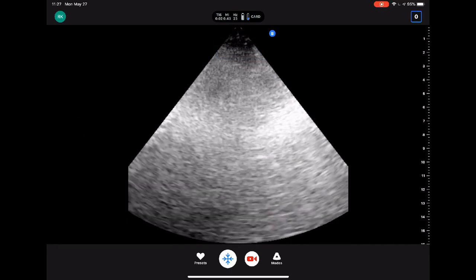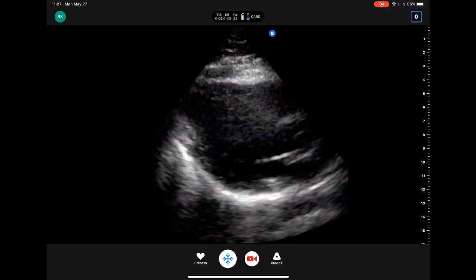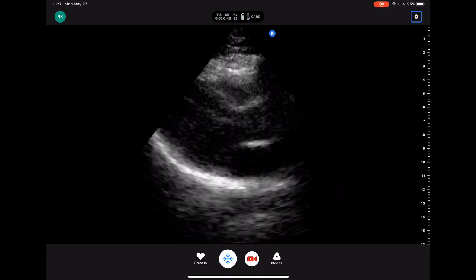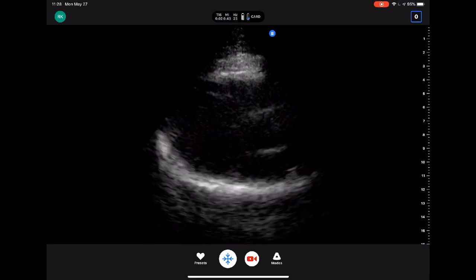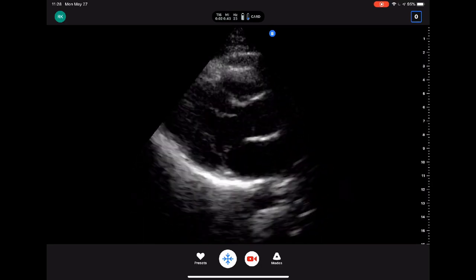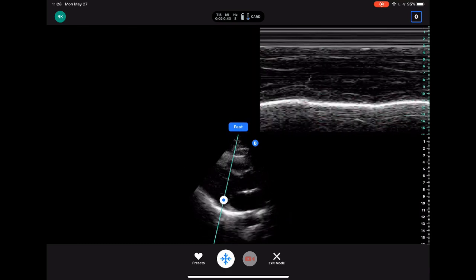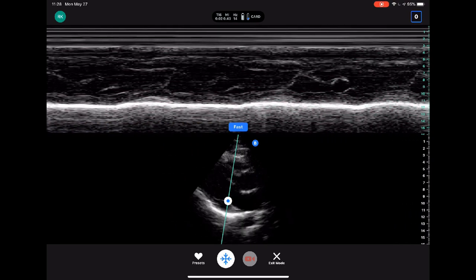Let's get started — I'm going to take a quick look at my heart. I've got some gel. So right there, this is a parasternal long view. Now what I can do is go down here to modes and do an M-mode through the mitral leaflet tips. This can sort of get you an E-point septal separation, which looks pretty good.